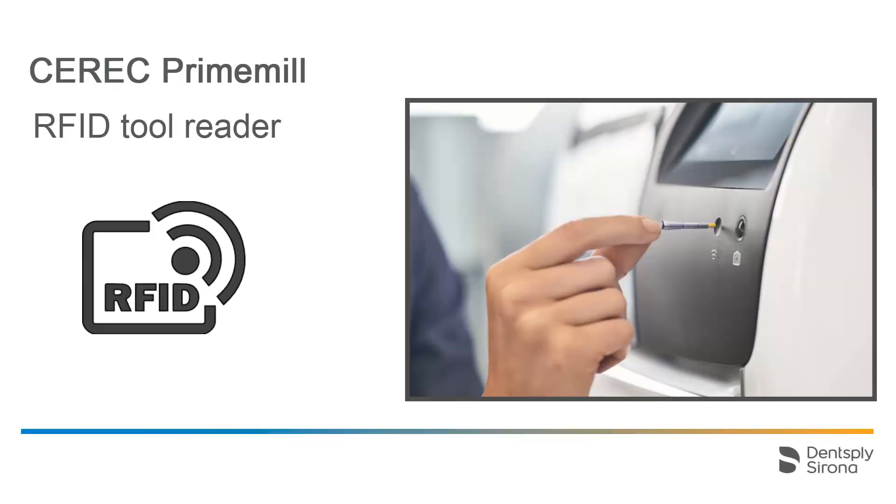The CEREC PrimeMill is equipped with an RFID tool reader. Therefore, the instruments are equipped with an identification chip, which the integrated reader of the device can read. The chip transmits information about the instrument type and its level of wear, which is displayed on the touch interface and stored in the device. With the optionally available Dentsply Sirona hub, instruments can be exchanged between several PrimeMills, and their condition is transferred and further tracked. Next, we will look at a video that demonstrates how the first instrument for the super-fast milling use case for CEREC Zirconia is mounted.